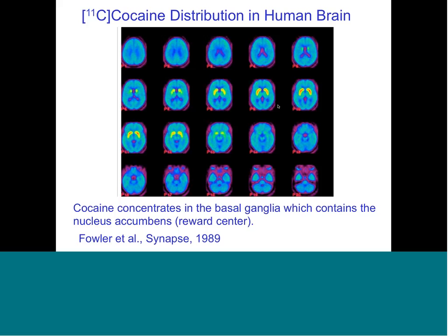And this was slicing the brain like you go from the top of the head down to the base of the skull. And this is a rainbow scale. So where it's red is actually where that molecule is in the brain. So we've sliced from the top down to the cerebellum. And you can see that the cocaine is very much localized in what's called the basal ganglia, or the reward center of the brain, which was, cocaine's kind of a dirty drug. It binds to a lot of things, but we were very pleased to see how exquisitely this localizes in the brain. And the most surprising thing we learned about it is how much gets to the brain. A huge amount. You inject cocaine, you smoke it, whatever, a huge amount gets into the brain.